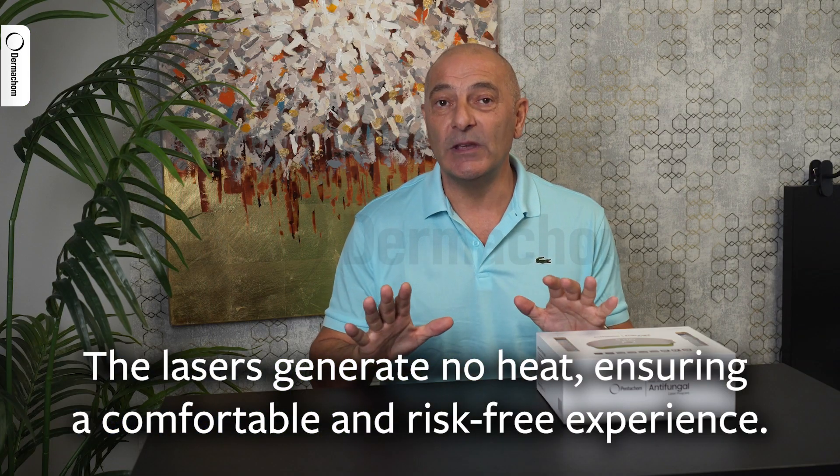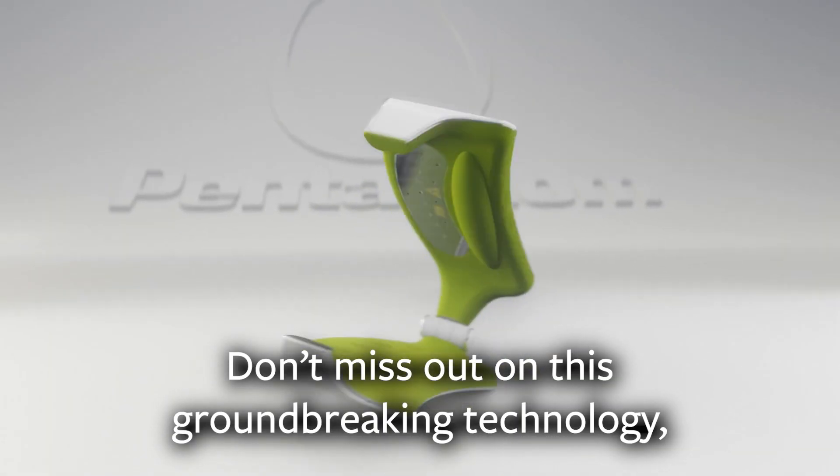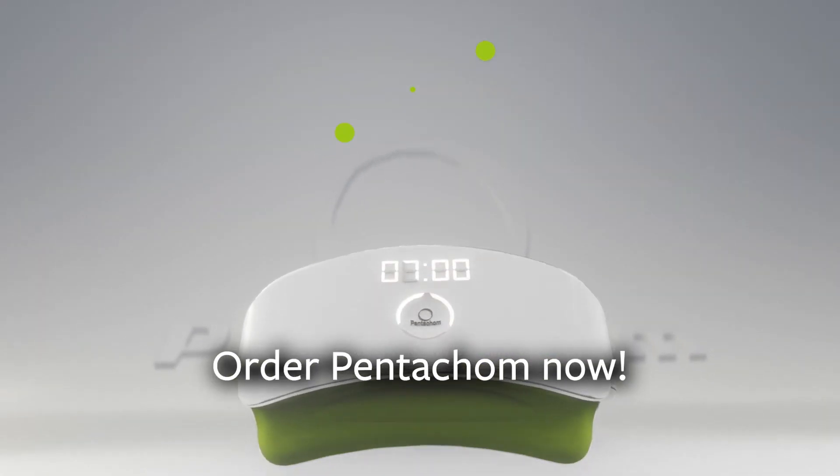The lasers generate no heat, ensuring a comfortable and risk-free experience. Don't miss out on this groundbreaking technology. Order Pentachom now.